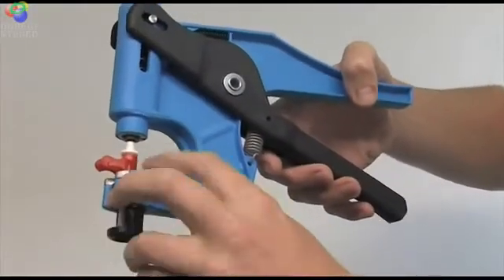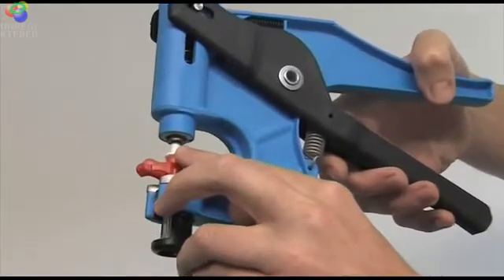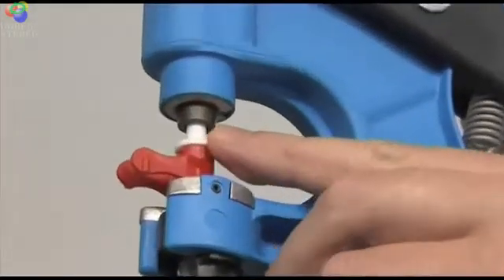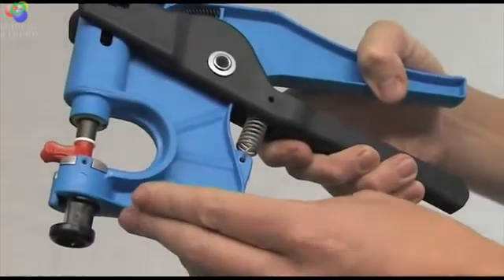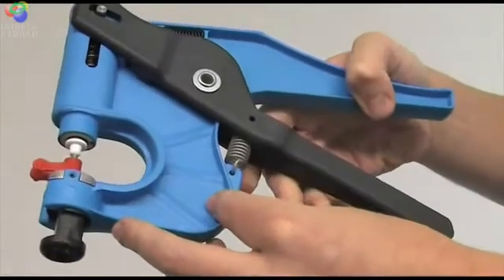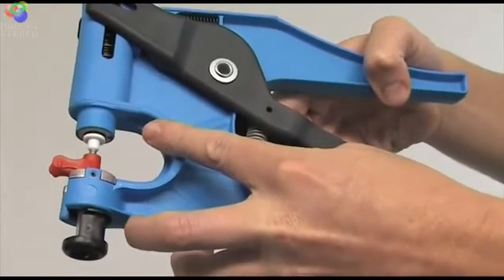Squeeze the handles together and ensure that the top part of the punch is sliding inside the metal gun bolt that comes down as the handles are squeezed. Only squeeze the handles until the gun bolt reaches this point and then release the handles. The gun bolt retracts upwards, taking the punch cutter up with it.